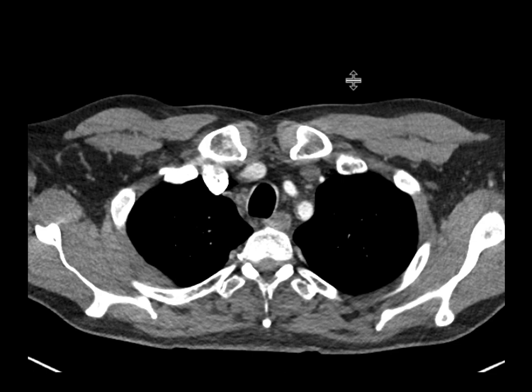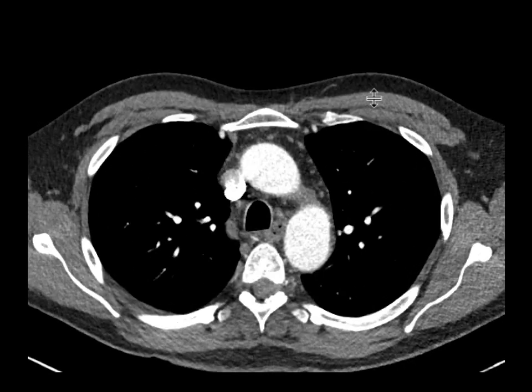This is a patient who came in with pleuritic chest pain as well as shortness of breath, and a CT scan utilizing a pulmonary embolism protocol was obtained.